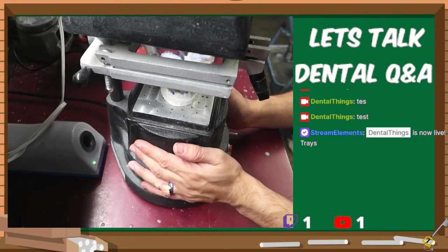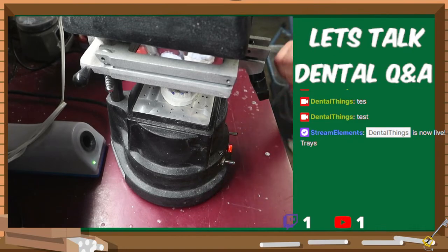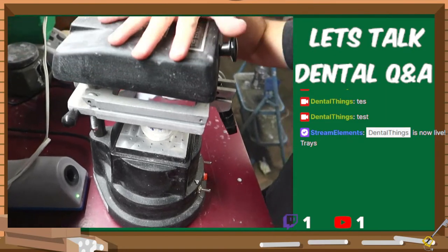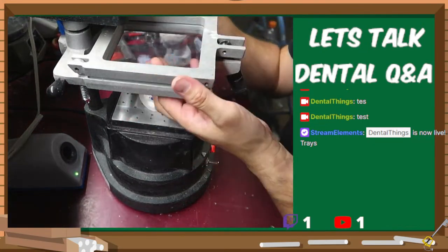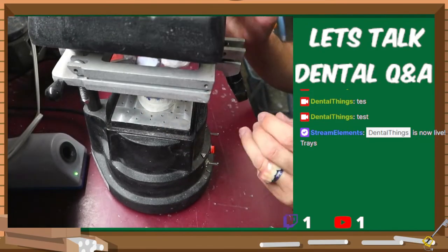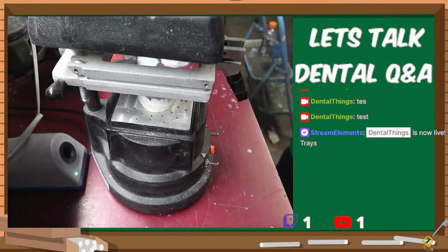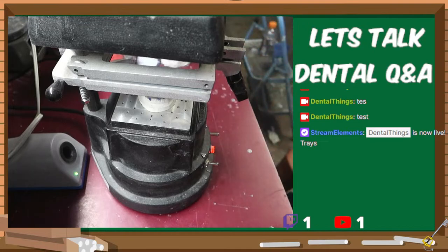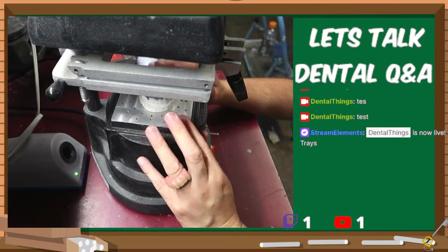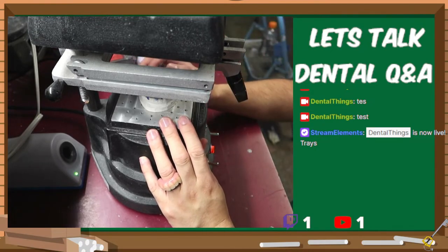All right, so we got our unit. First I'm gonna take this portion and throw this on. That's gonna start up a heating element that lies right here at the top. And as that heats up, it's going to heat up this thermoplastic that's nice and rubbery. It's gonna make it droop. And then I'm gonna go and slam it down onto my cast. And we will get started on making that night guard. But in the meantime, all we do is wait while this gets heated up, which it is heating. Good.